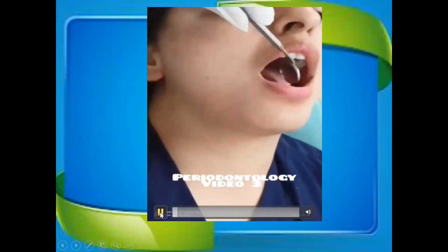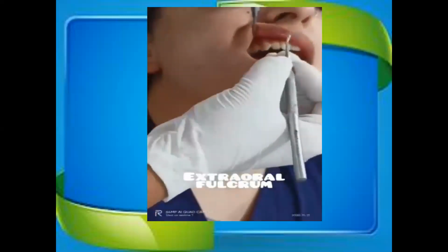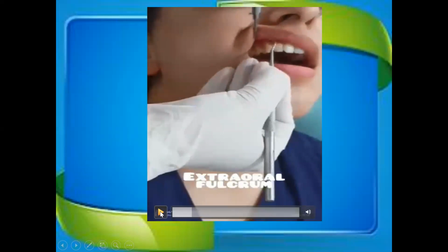This is again a video demonstration for extraoral fulcrum. So this is palm up fulcrum. We are resting the back side of the middle and fourth finger on the skin overlying the lateral aspect of the mandible on the right side of the face.